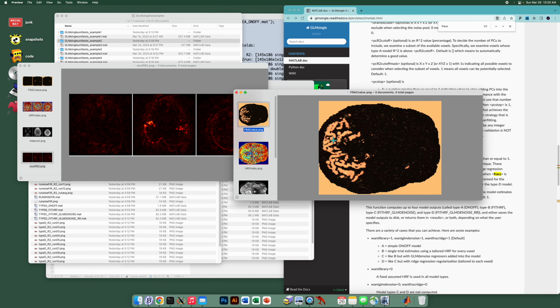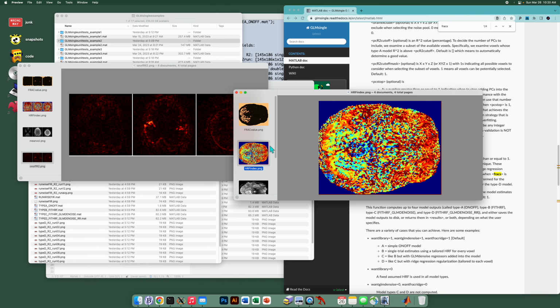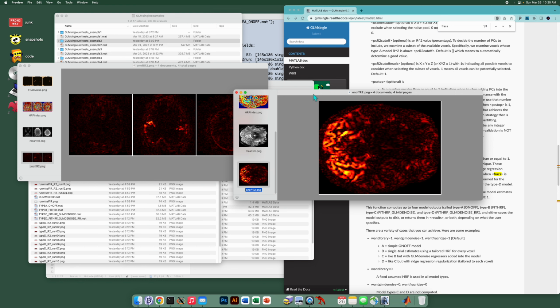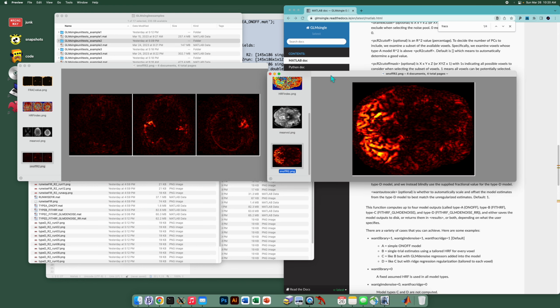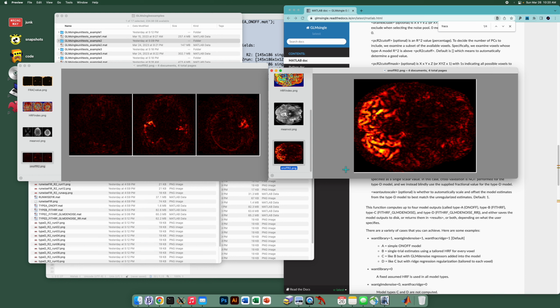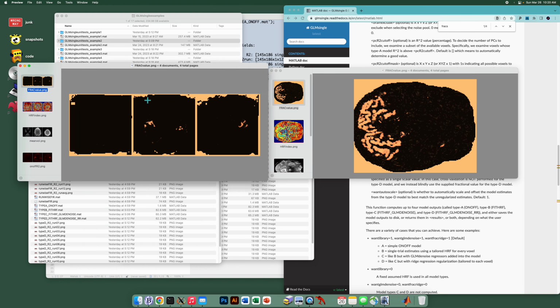Okay, so if we compare these data sets, they actually have drastically different SNR qualities. And this is a function of many things: the field strength, the spatial resolution, the compliance of your subject, the efficacy of the design, whether it's short events, long events, blocks. So many of these differences are expected, but the goal here is just to try to understand what we're seeing.